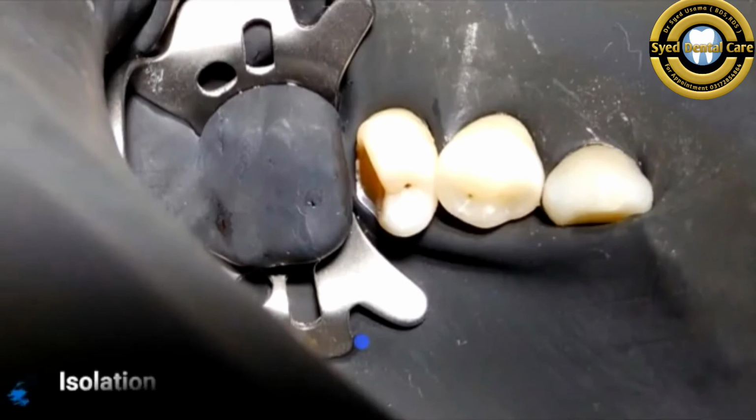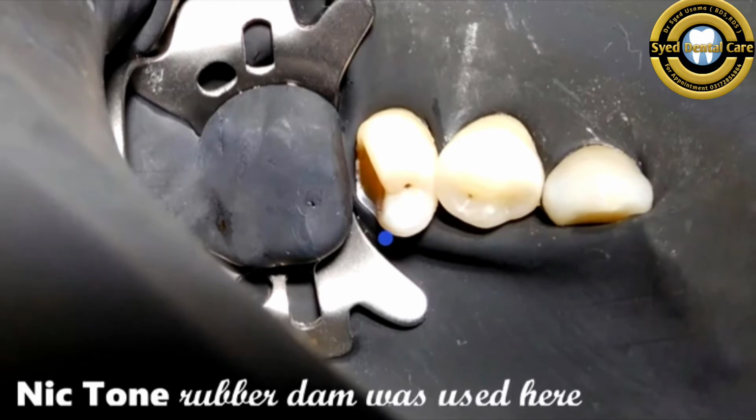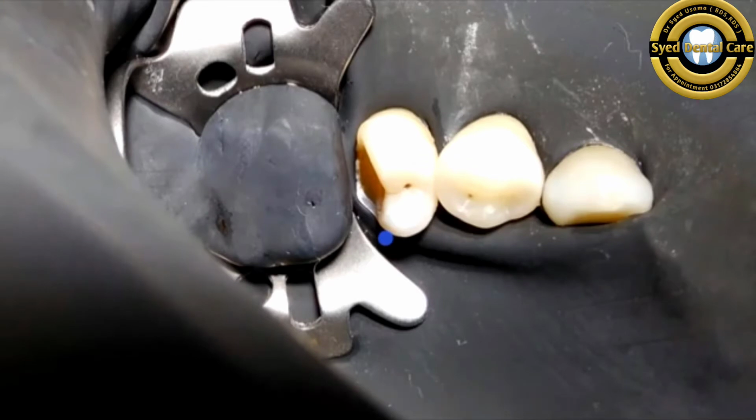The next step is rubber dam isolation. So rubber dam isolation was done. We all know that rubber sheet is available in 3 options: heavy, medium and thin. We are using heavy here because it has stronger recoil. The color chosen here is black, because it provides better contrast and aesthetic documentation of the case, because we have to take pictures. Therefore the black background provides a very good contrast in the images, as you can see here. Obviously the credit goes to the one who actually took the picture, an amazing doctor he is.